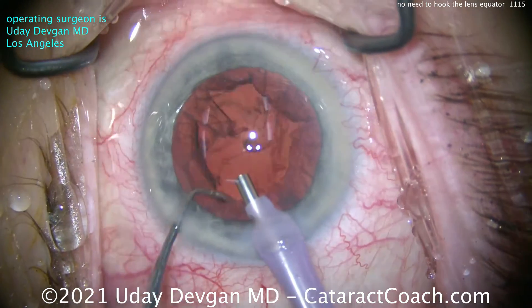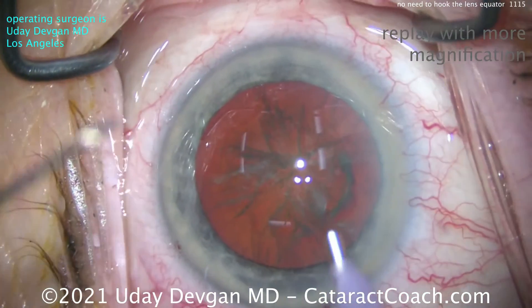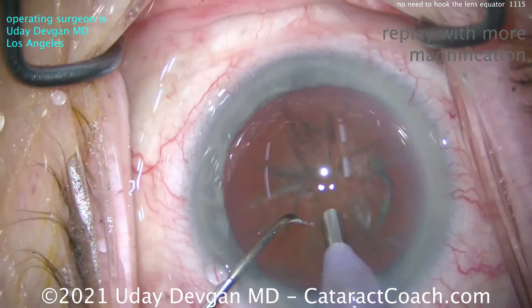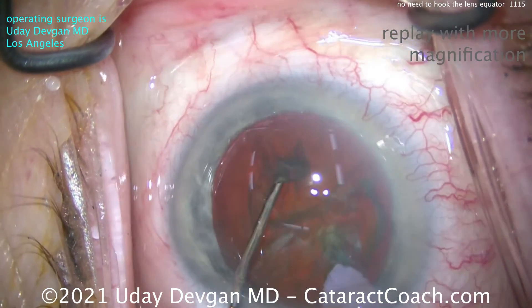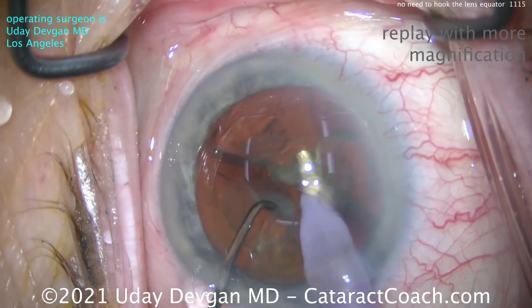Now let's watch it again in higher magnification and then repeat in slow motion. In high mag, you can see the phaco probe placing just inside that sub-incisional capsulorrhexis. The chopper is pushed into the nucleus straight down, then bring the instruments together and apart to create two halves.